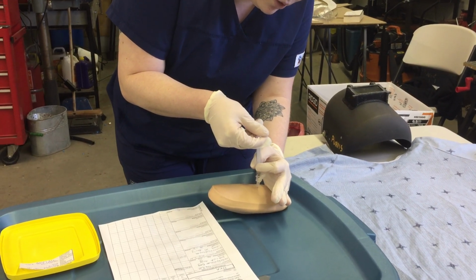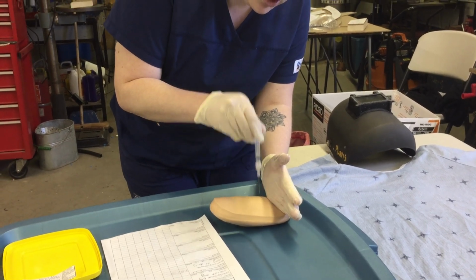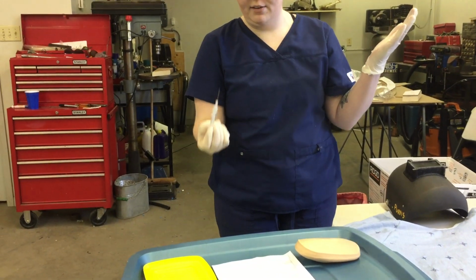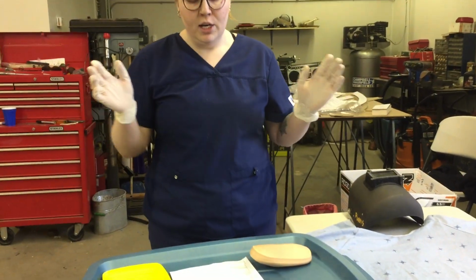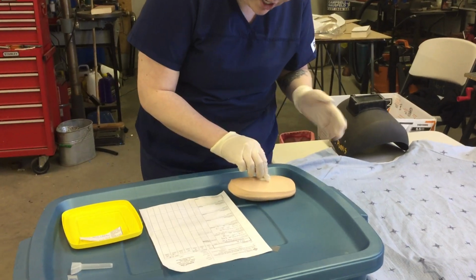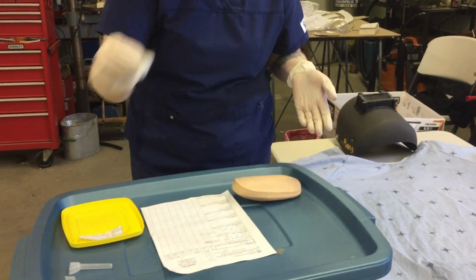So once I've done that, I'm going to wait a couple seconds, and then I'm going to remove my stabilization. I'm going to remove the needle in a swift motion. I'm going to remove my Z-track, and I'm going to activate the safety of that needle, and I'm going to discard this in the sharps. For demo purposes, I'm not going to activate the safety, but that's what I would do, and then in the sharps. So after I've done that, I'm going to hold my cotton ball onto the spot where I gave the injection, making sure not to massage the site. So at that point, we're just going to say that's about 30 seconds, and we'll throw that in the garbage.